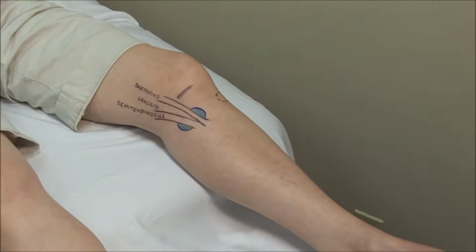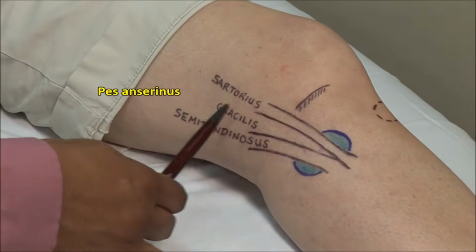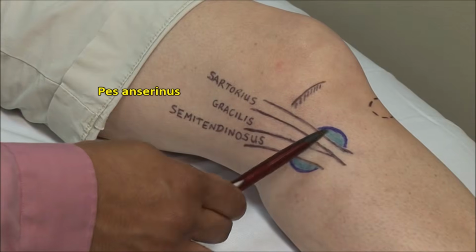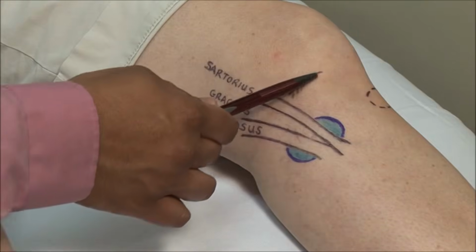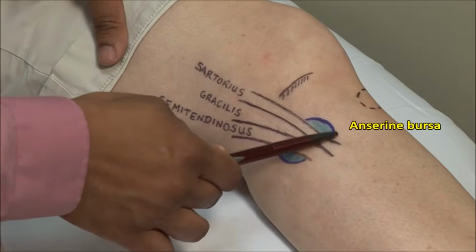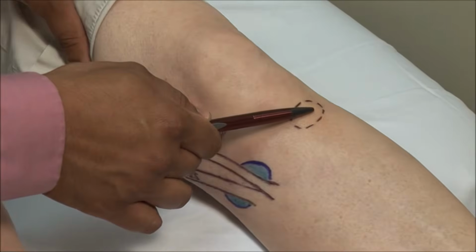The pes anserinus refers to the conjoint tendons of the sartorius, gracilis, and semitendinosus muscles. These attach to the anteromedial aspect of the tibia, inferior to the joint line. The anserine bursa is located anterior to these tendons at the level of the tibial tuberosity.